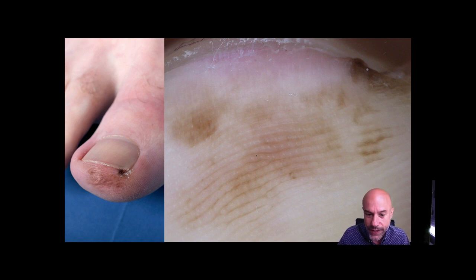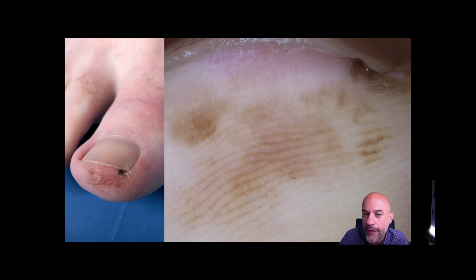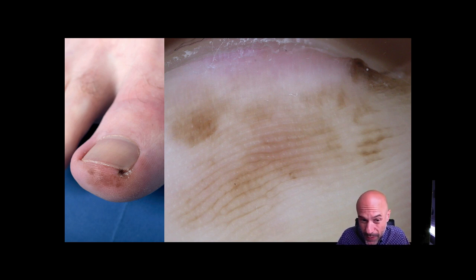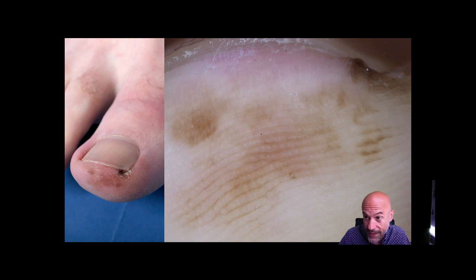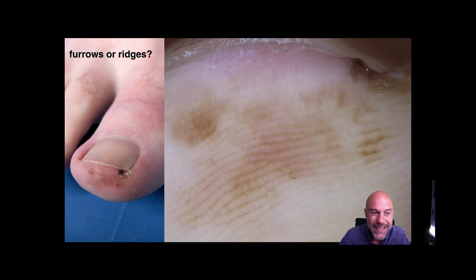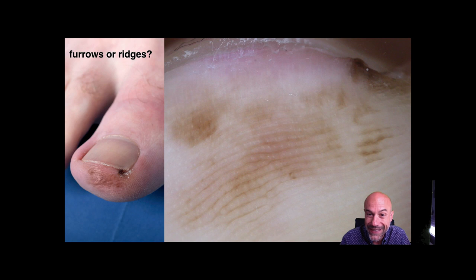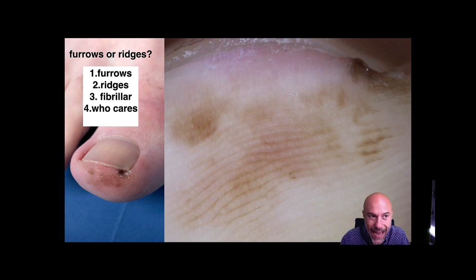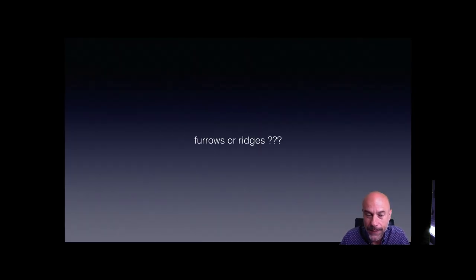For instance, in this lesion, if you try to answer furrows or ridges, it could be that the response would be mainly furrows — and this could mislead you to the conclusion that it is a nevus. But if you assess the overall symmetry of this lesion, then you will not miss it, because the lesion is highly asymmetric in terms of colors and structures. This is particularly important in lesions where we cannot decide if the pigmentation is on the furrows or the ridges — in a case like this, the answer to the question furrows or ridges should be: who cares, since the lesion is highly asymmetric.